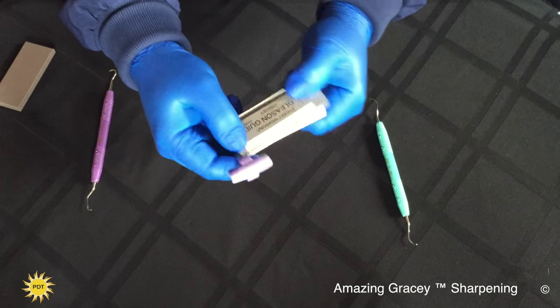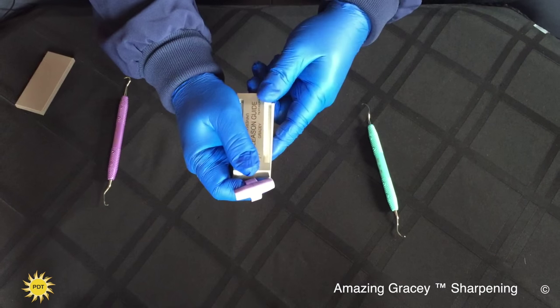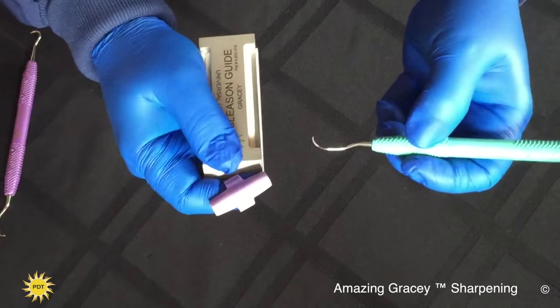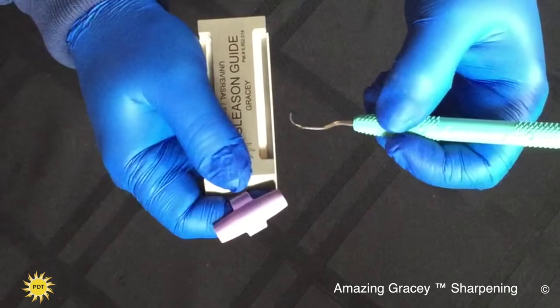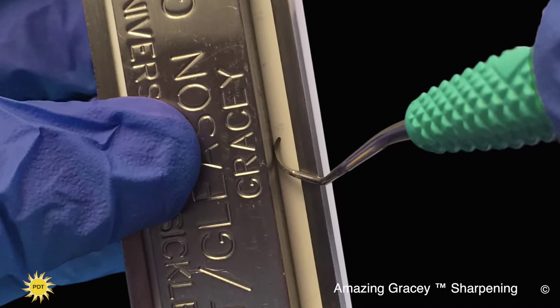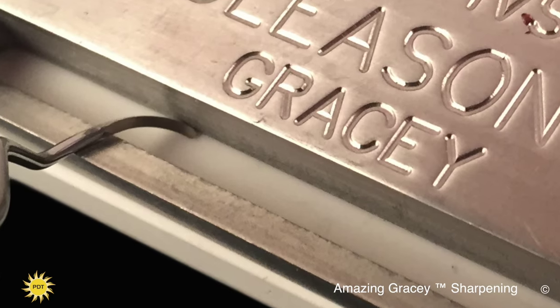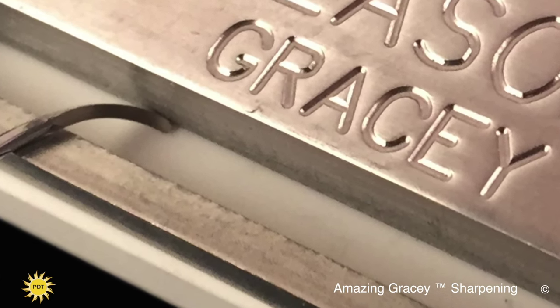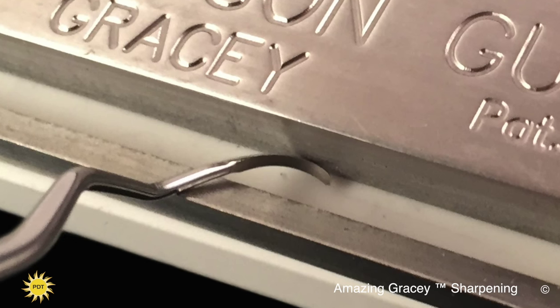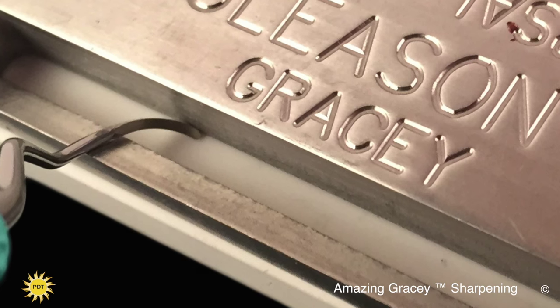To do the Gracie, you simply flip the guide around, place the ping ring on the end of the guide again. Because it's a curette and you want it to maintain its original toe, you still place the middle of the back of the instrument against the backstop, rest the terminal shank down onto the rest bar, and pendulum swing the instrument. But this time when the toe comes off the back of the guide, you stop when the toe reaches the guide as well.